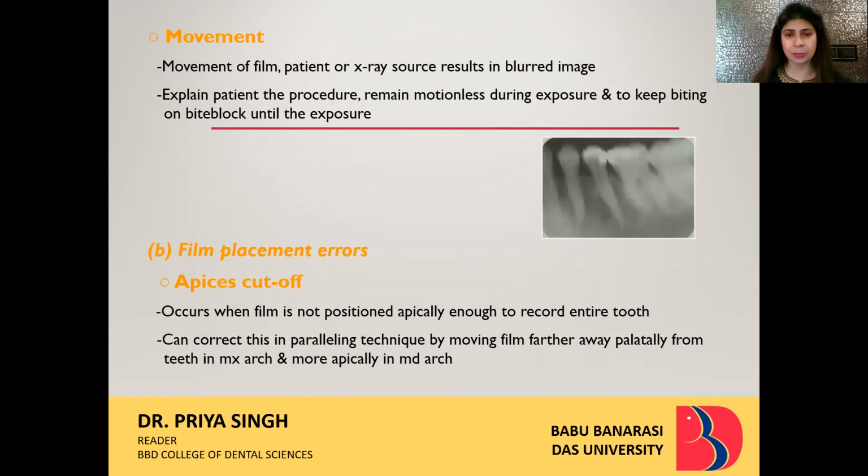Second very important aspect is you have to orient the patient about what you are going to do. You have to tell the patient that during the whole procedure, there should be no movement. The patient has to hold the film very firmly inside the oral cavity. Though we have different holders, at times a holder might lead to gagging. It might impinge on the soft tissue. So we make the patient hold the film, but you'll have to convey to the patient that the film should not move.